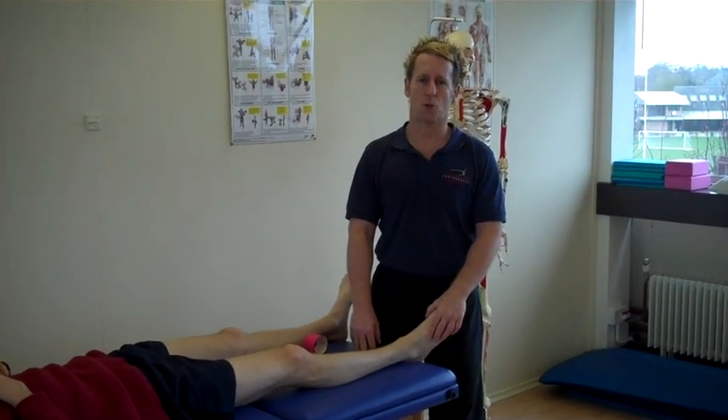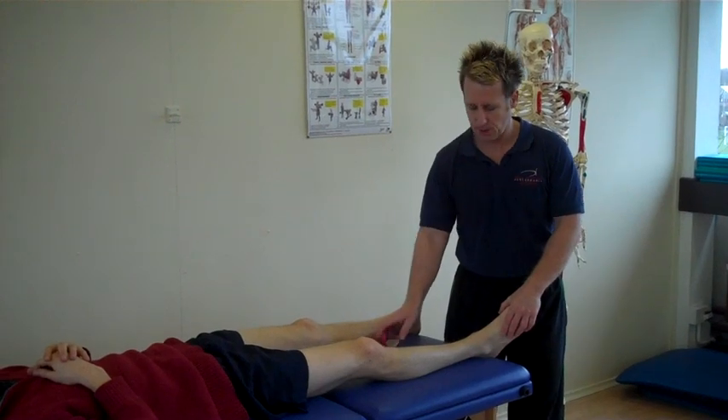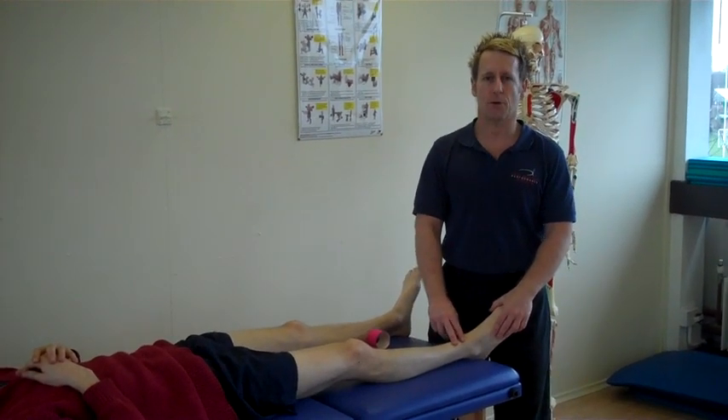Hi, my name is John Gibbons. I'm a sports osteopath and today we're going to look at taping using functional tape for the tibialis anterior.